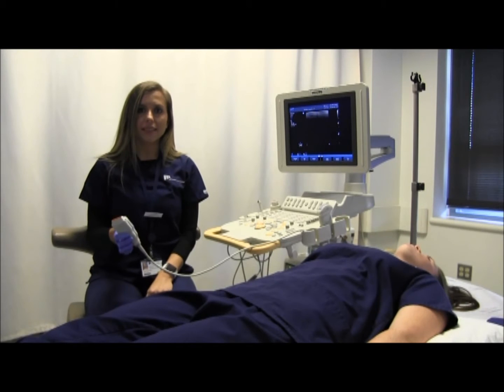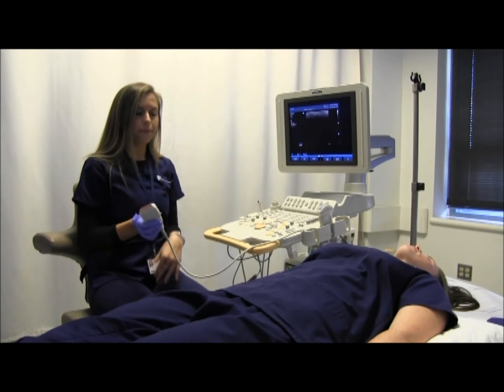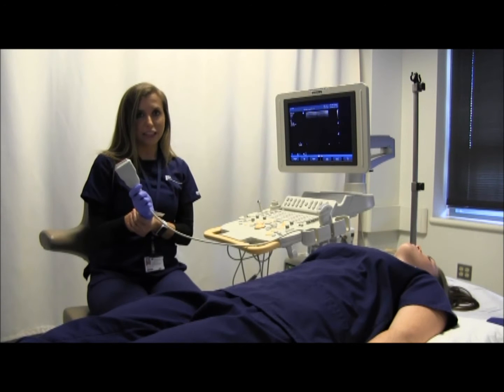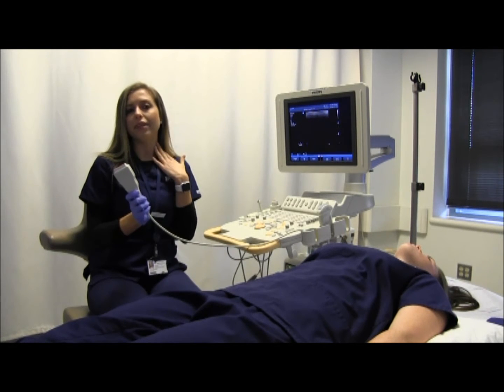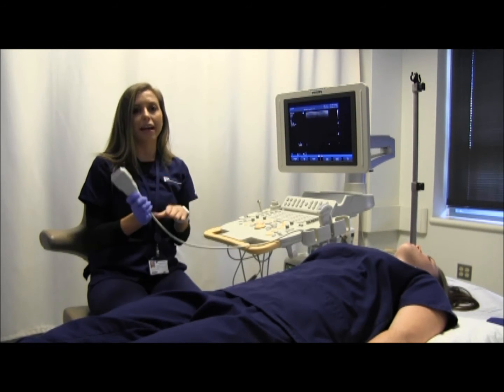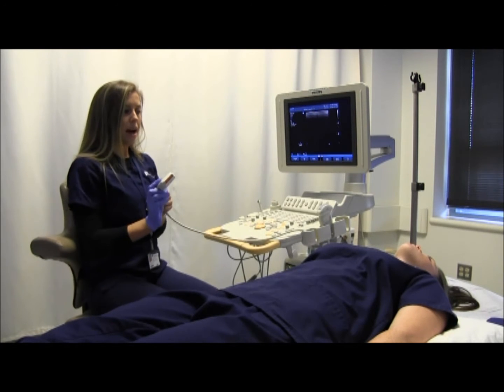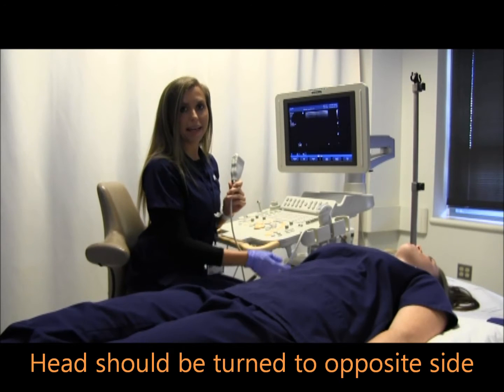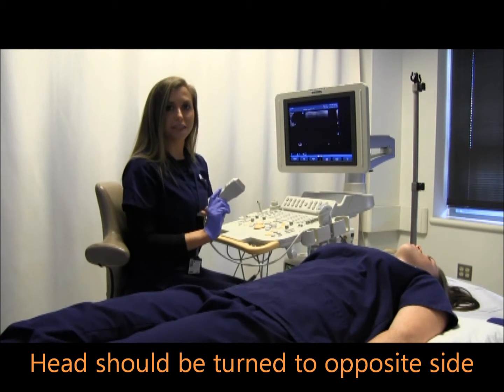For a neck study, the patient does not need to be NPO. Use a high-frequency linear transducer because the thyroid is a superficial structure, so the higher the frequency, the better. Then ask your patient to move their head contralateral to the side that you're scanning.